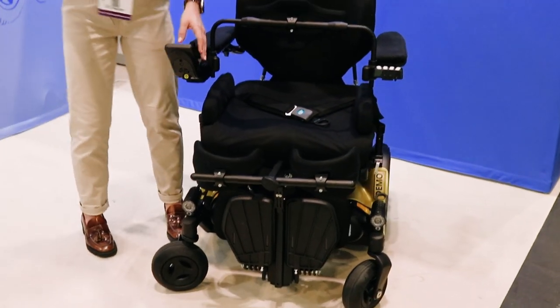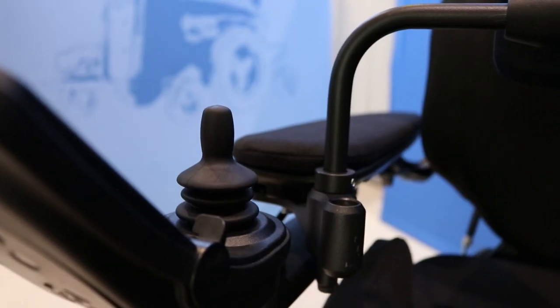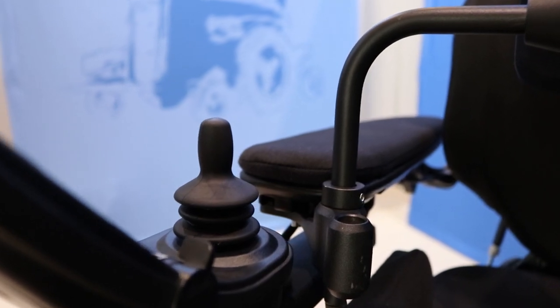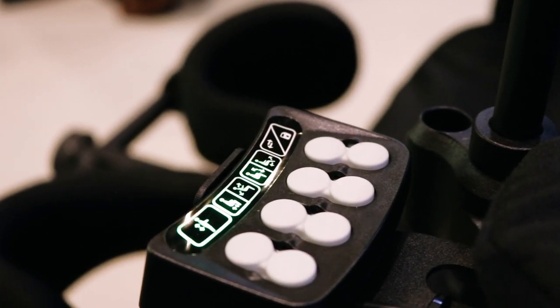We've got two options here for going into standing. I'm going to use the joystick, but we have got the ICS box here which can also be done with the press of a button.